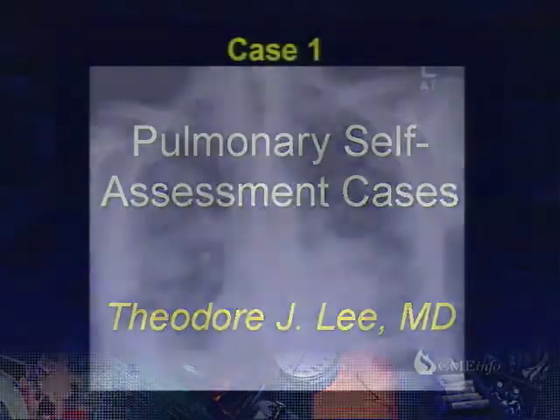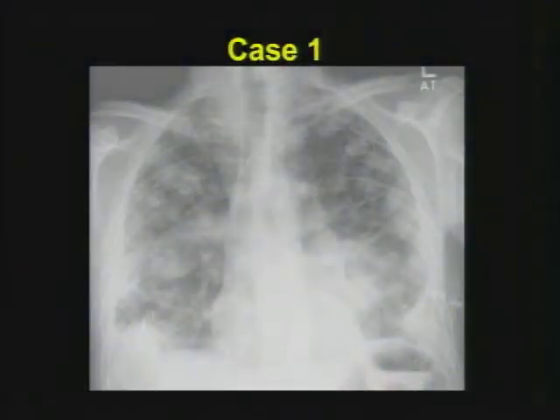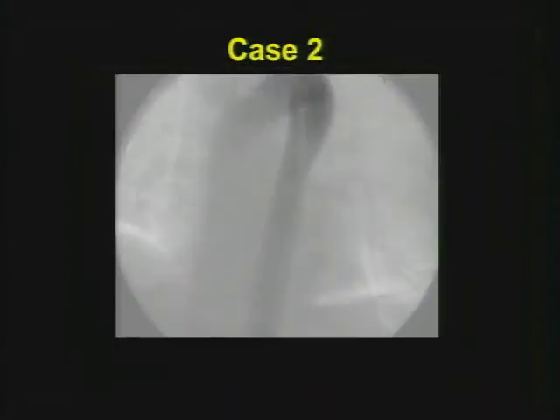Case number one: a patient who has multiple nodules in the chest. They have a fever. Perhaps you'll elicit a history of intravenous drug abuse, as in this case. It should be a fairly easy one to start you off.